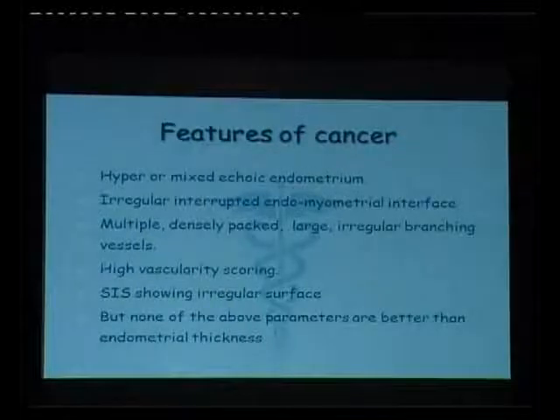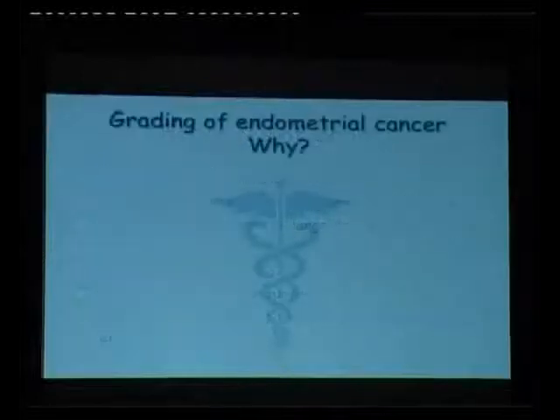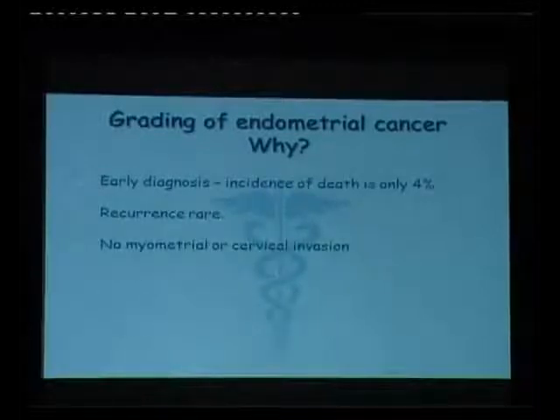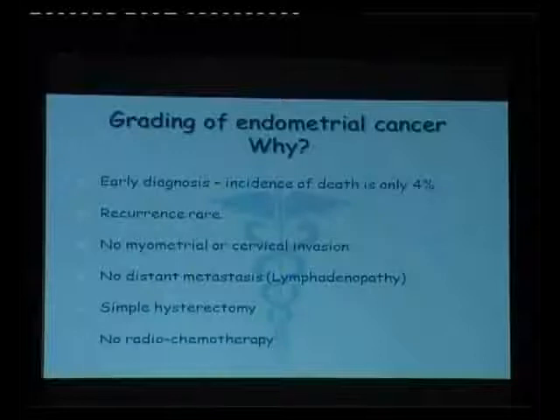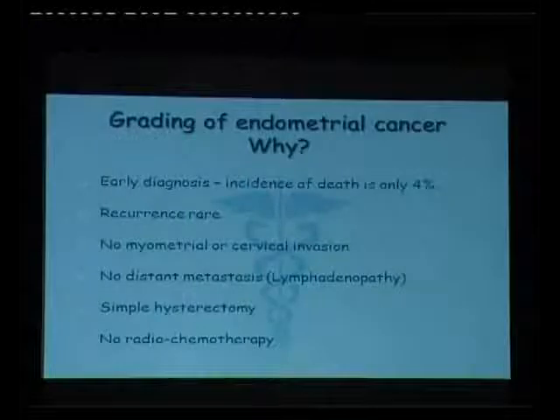Along with it, you depend upon the associated features like echogenicity, vascularity, vascular scoring, as well as saline infusion sonography. Now, we have to grade the endometrial carcinoma. Why should we grade it? The reason is that if you can grade it, we can diagnose them early. If you diagnose them early, the incidence of death is only 4%. The recurrence rates are very rare, there is no myometrial or cervical invasion, and there is no distant metastasis or lymphadenopathy. Simple hysterectomy is the treatment of choice, and there is no need for any radiochemotherapy.